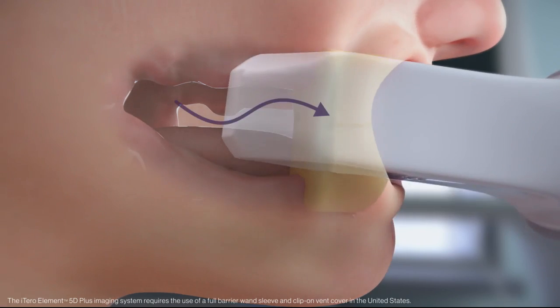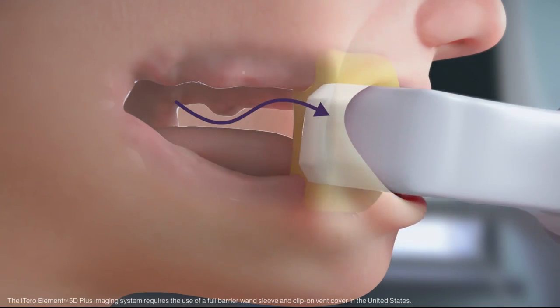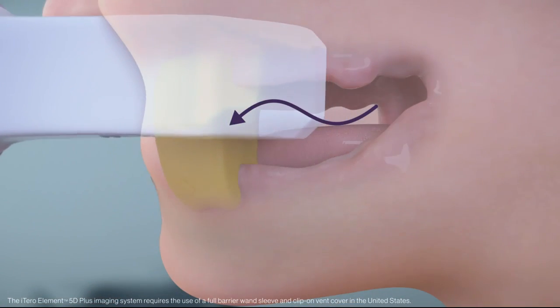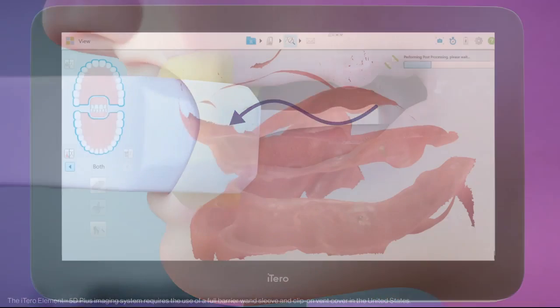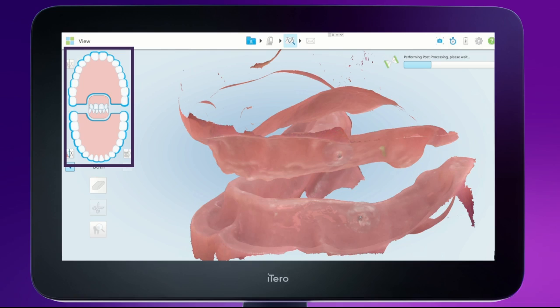Scan the right and left bite at the posterior until the scanner registers the bite and the 3D model comes together. Click the view icon to switch to view mode. Tap on each of the jaw and bite segments to check if all the anatomical parts of the soft tissue are captured.